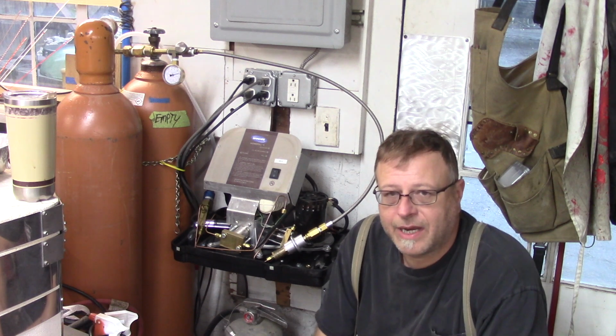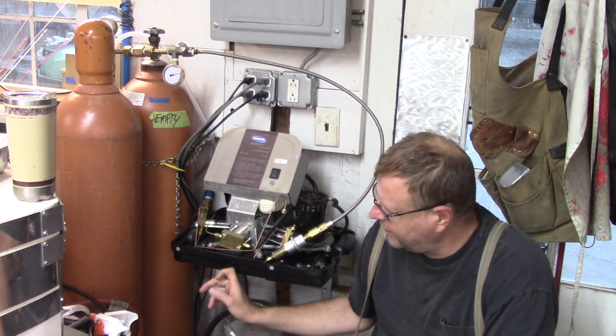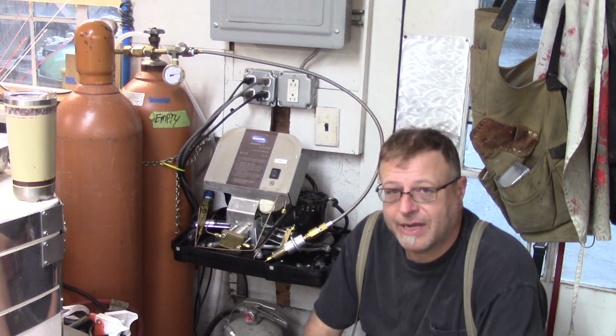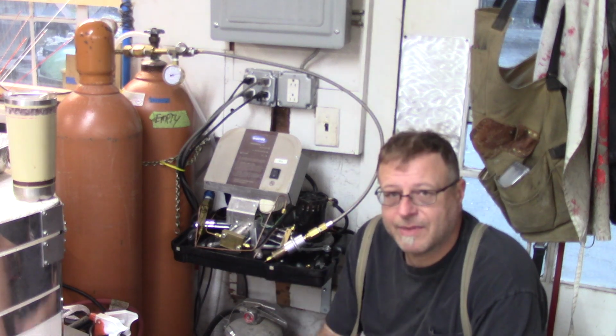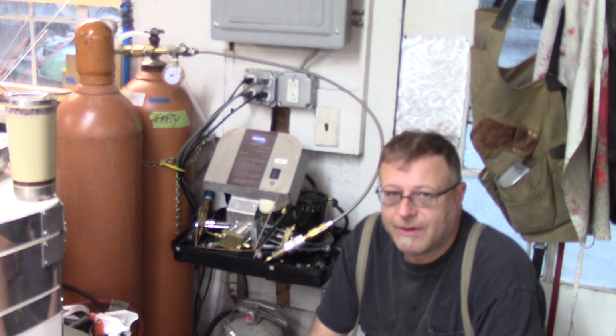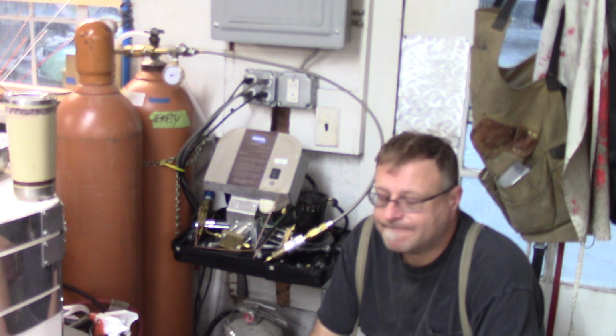If you've watched any of my other videos, you'll know that this is my Invacare HomeFill 2 oxygen compressor. If you watched any of my other videos, you'll notice that this is the first time I ever actually shot this thing with the top off of it. Well, the top's off of it because, quite frankly, I blew it up.